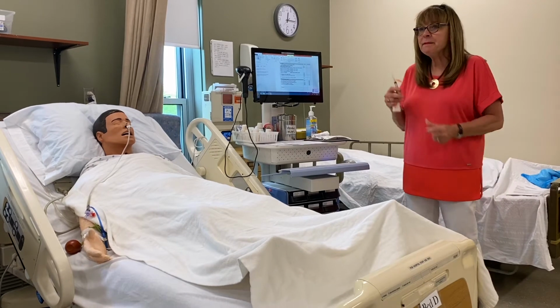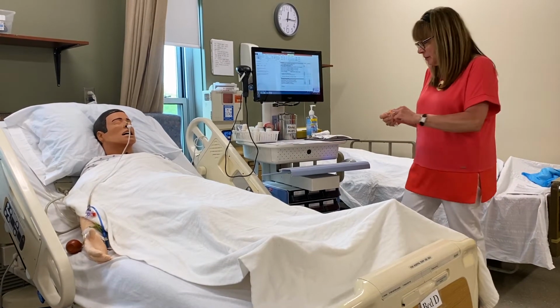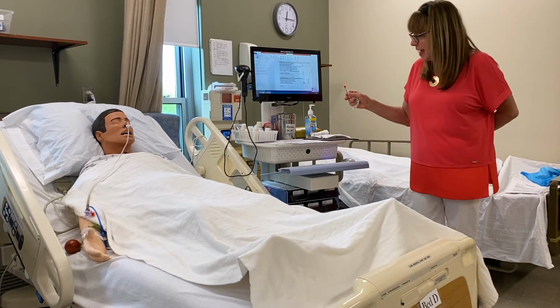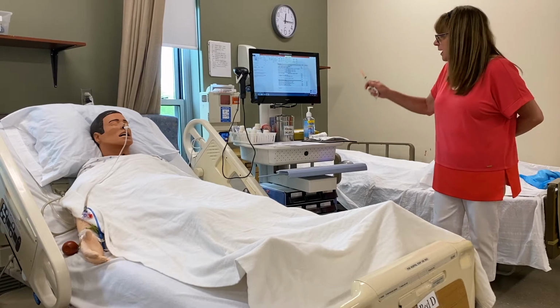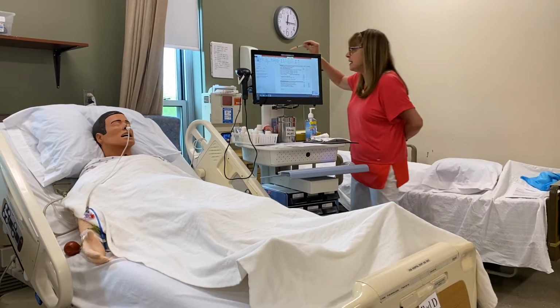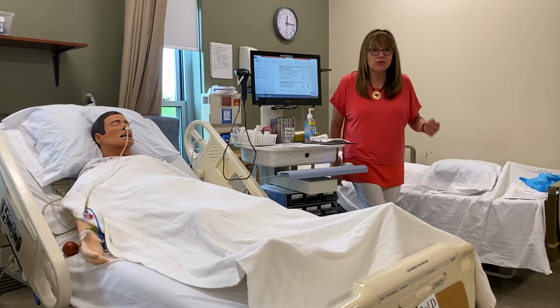Remember, always, when you are getting rid of a needle that's been in the body, you never recap. They all have a safety cap. You're going to lock it in place and always use a one-handed technique to get the contaminated needle into the sharps container so you don't stick yourself.